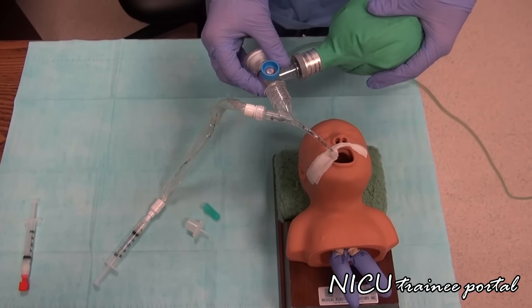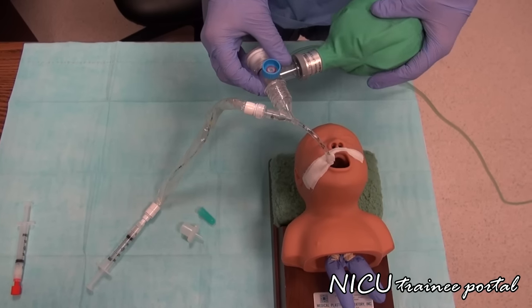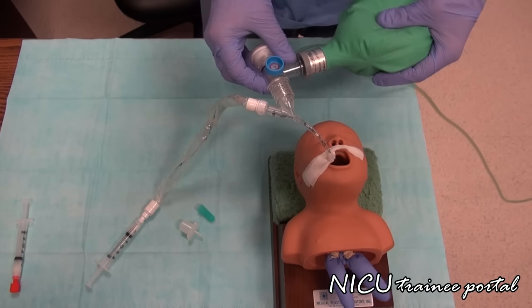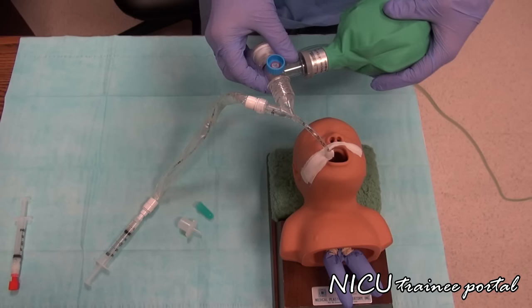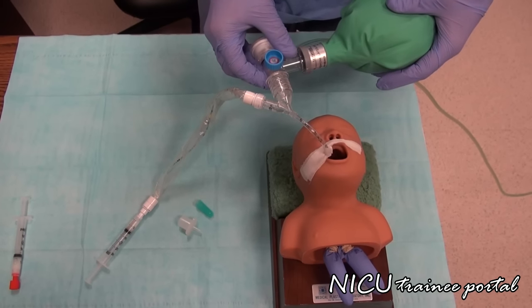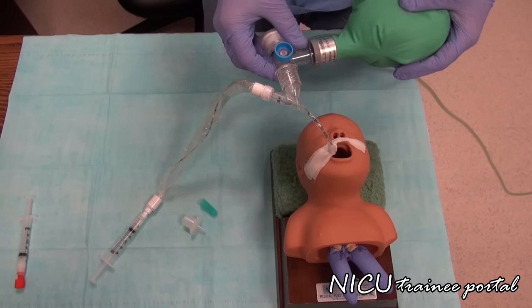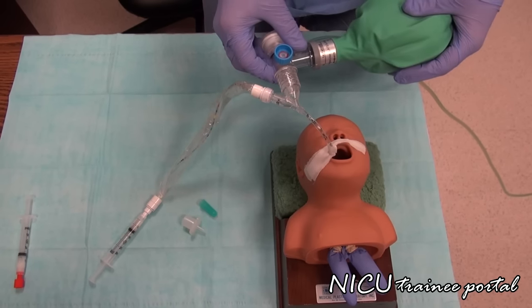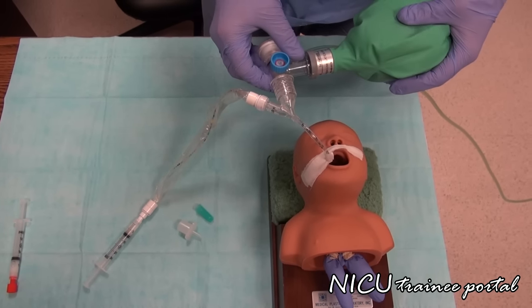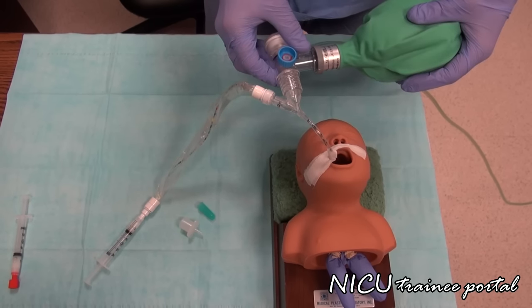At this point we can resume manual ventilation. The next step is inserting the catheter to proper placement, administering the surfactant, and removing the catheter, making sure our patient is stable through the process. We have to properly measure the correct depth in the ET tube and then administer the surfactant.